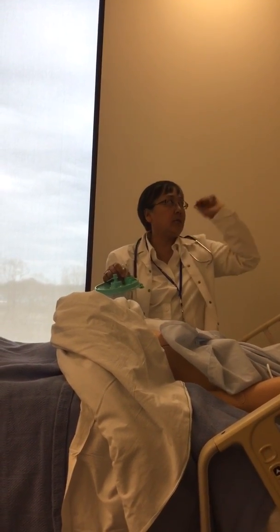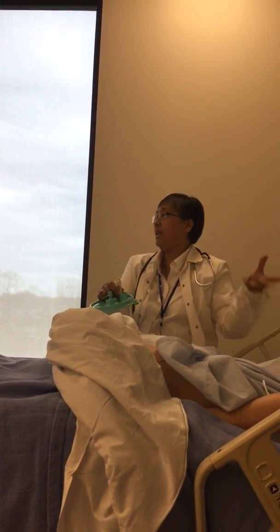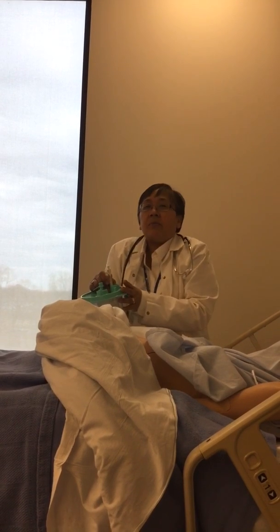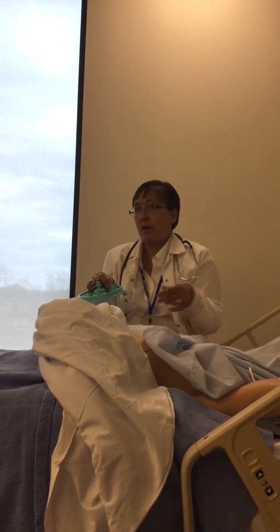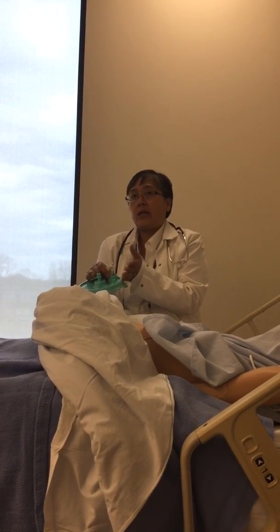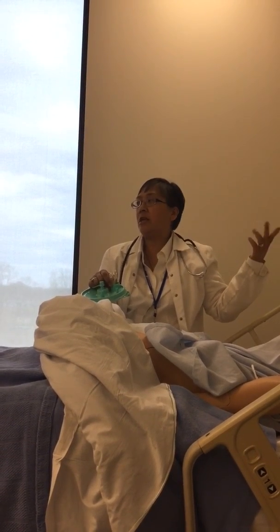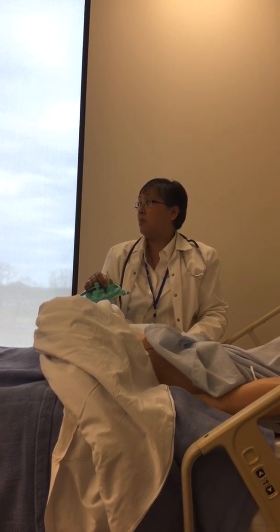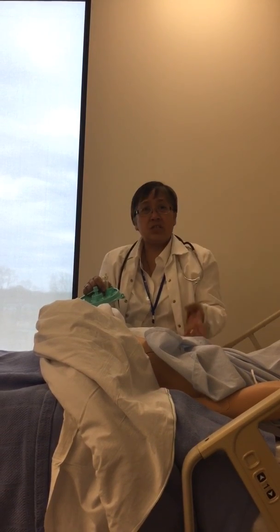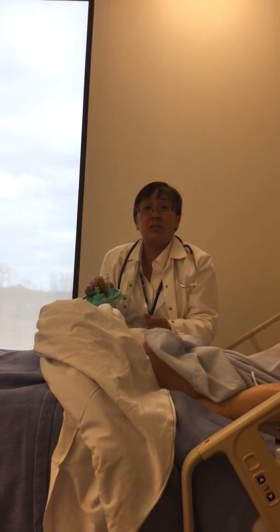If I had a continuous feeding, it's like an IV, and it continually pours into here if the patient wasn't eating by mouth. Because why would a patient have a G-tube if they weren't having problems swallowing or something? Okay, so if I'm going to give medications, say at 9 o'clock, you could turn off your continuous feeding maybe 10 or 15 minutes before you actually give it. So they've digested it, and you want to make sure that you're not getting all this residual.